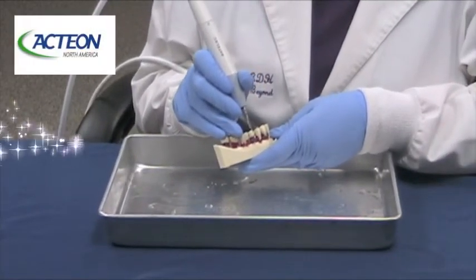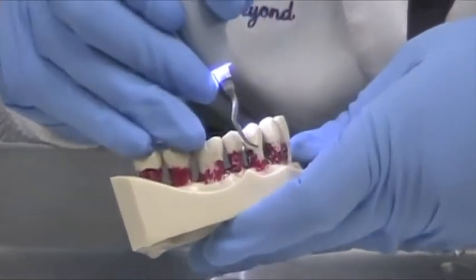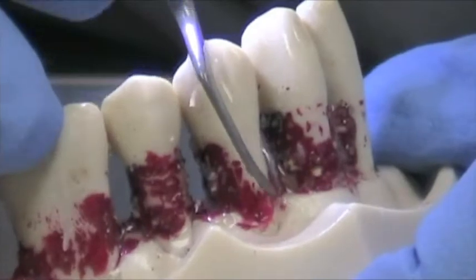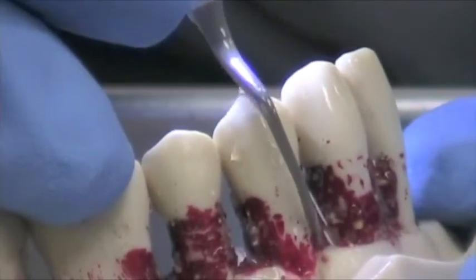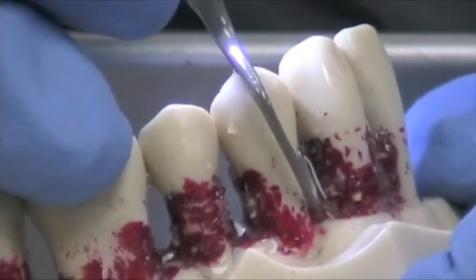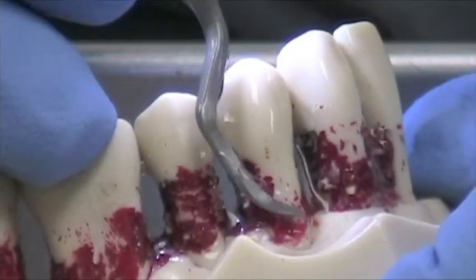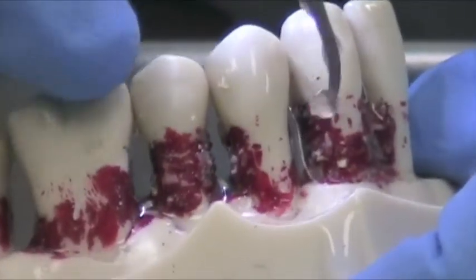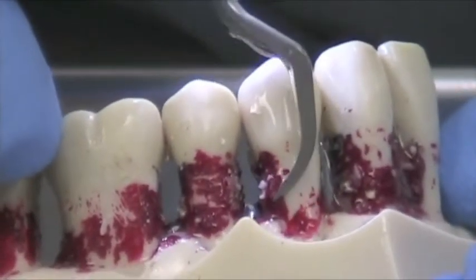I'm going to now demonstrate the PH1 tip. The PH1 tip, as you can see from the anatomy, it looks like a curette. It's for anterior teeth. It's good for around implants, good for around veneers, and full mouth crown and bridge when you just want to do biofilm disruption. It's universal in the fact that you can just pivot and go to the distal portion of the tooth.